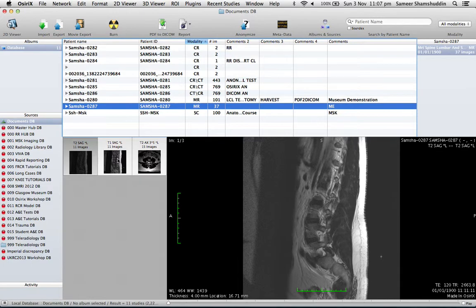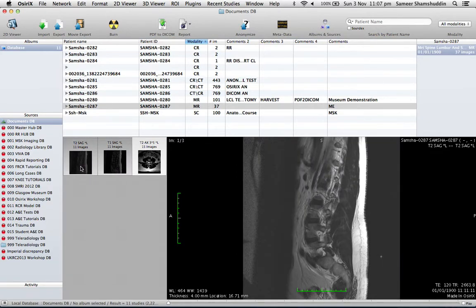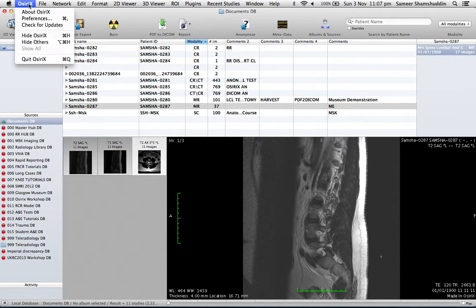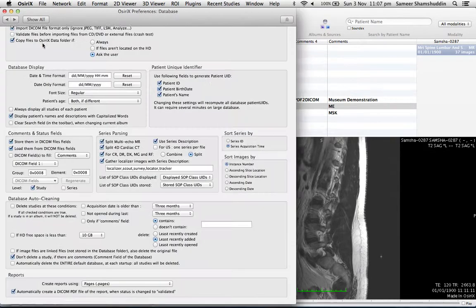This is the tricky bit: you simply cannot drag and drop the series from one side to another side of the screen. What you need to do is check your OsiriX preferences. So go to OsiriX, click Preferences, and then click Database.